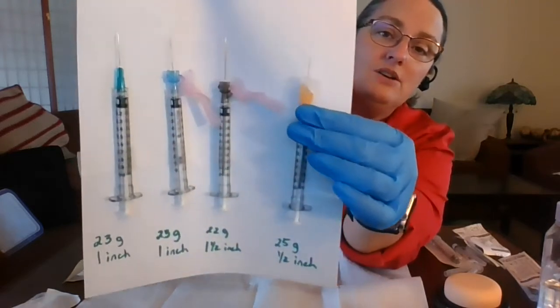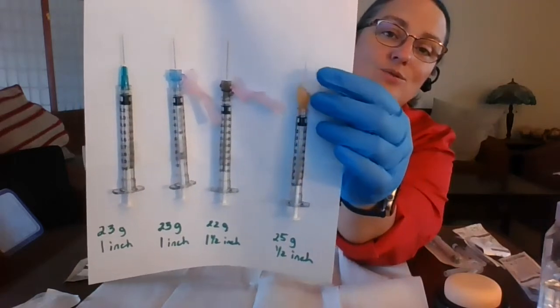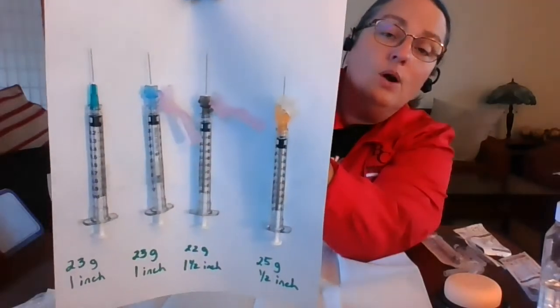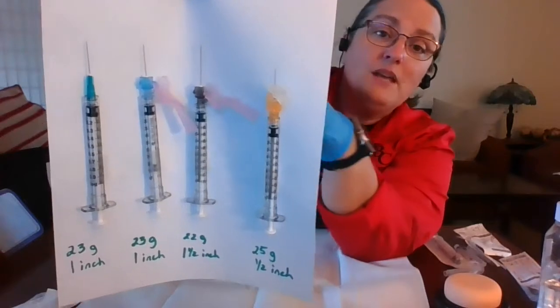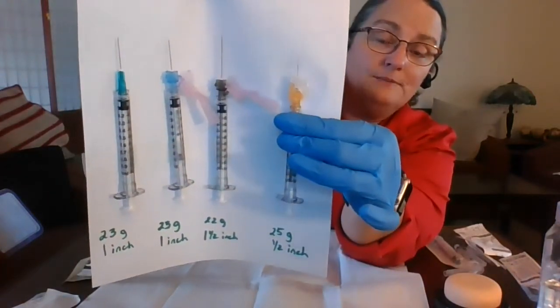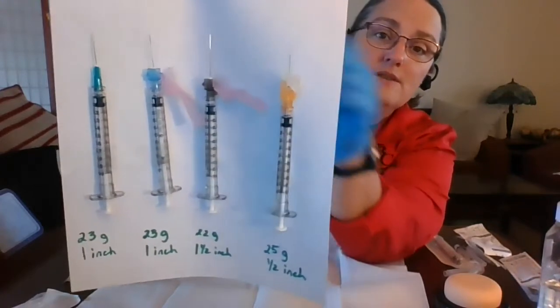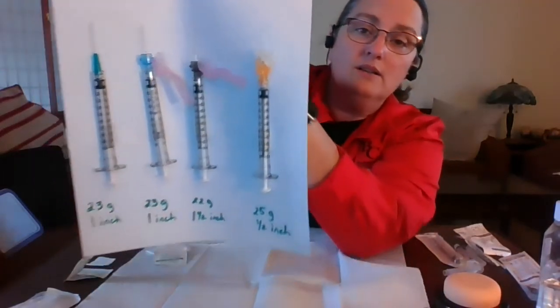And then this one here is a 25 gauge, so the smallest size, and it's only a 1/2 inch. Typically, this is what we use to give vaccines to children or to babies because those muscles are smaller. We also use this in adults if we're giving a subcutaneous, just under the skin injection. So those are our different sizes. I'm going to take some pictures and include them in the lesson as well.